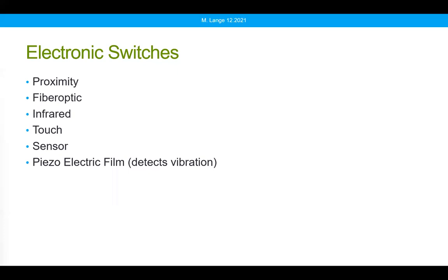Lorna has said, do you know of any switches like this that would allow for vibration for the student to feel that they have hit the switch? The switch would be used on the foot and out of sight. Enabling Devices actually has a lot of switches that vibrate when you touch them. But most of those switches are large switches that have a higher activation force requirement. And so those are not generally appropriate for someone with muscle weakness.